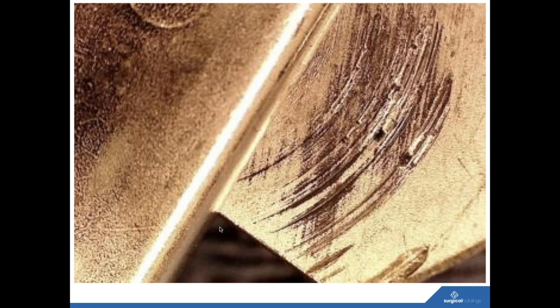So just to share a few common images we see, which I'll run through relatively quickly. This is the sort of corrosion that you might find in box joints and some scissors, where there are perhaps no signs of corrosion as yet, but where a lubricant may not be used with the instruments. And it's the same story with the surface of the device. If the instruments wear through and the surface of the steel is compromised, then of course that will leak free iron and the process starts. So the message there is that if you see those tide marks occurring on your instruments, act quickly and ensure they're lubricated, to take care of them.